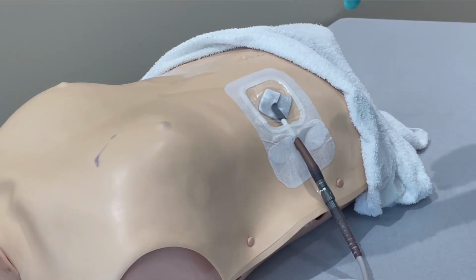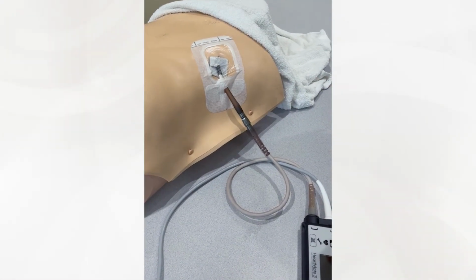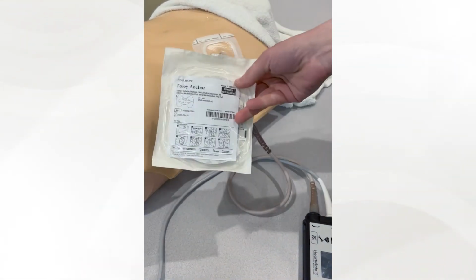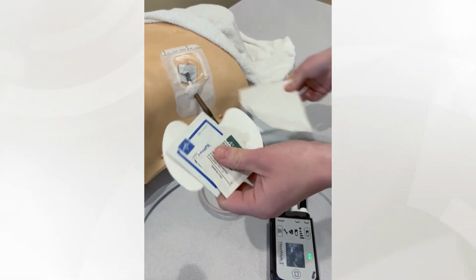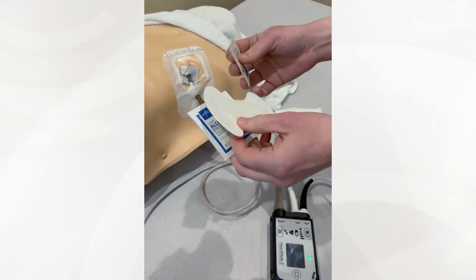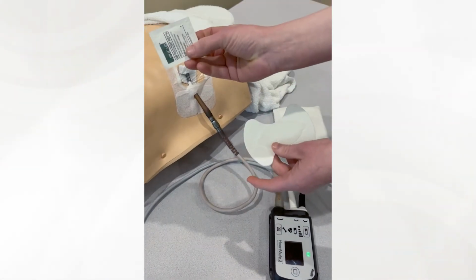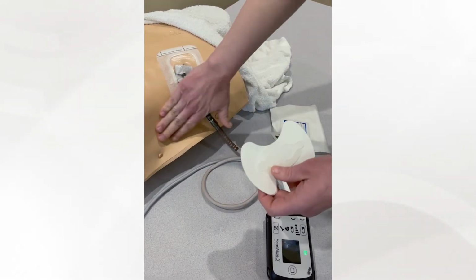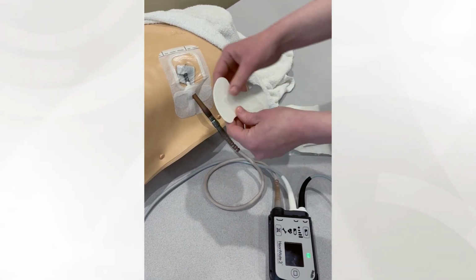The last step we have is just to apply the anchor. So the final step of our drive line dressing change is to apply this anchor. You're gonna grab a Foley anchor. This does not have to be sterile. You're going to open it up. If the skin is feeling a little bit oily, you can use the alcohol pad to dry out the skin a little bit. And then it also comes with some skin prep to help stick the anchor on. This patient is very dry, so I'm going to skip both of those, but those are optional items.